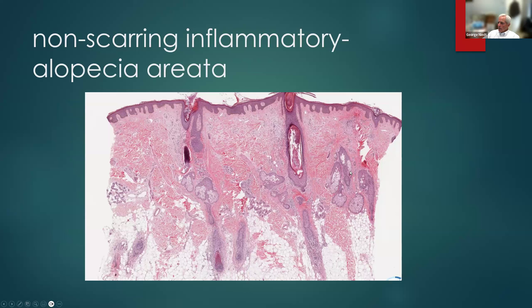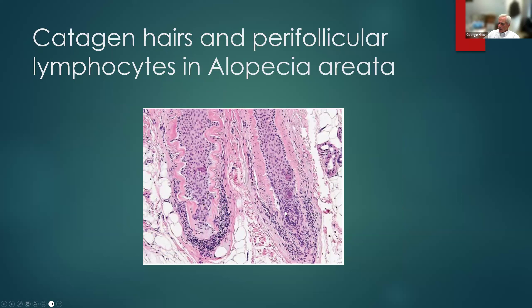Here's our classic lesion of alopecia areata. We have plenty of hairs — one, two, three, four, five, six, seven hairs — and all the hairs are starting to regress at the same stage of devolution, as Bernie Ackerman used to say. This is the histologic correlate of what we see clinically: you don't lose one hair at a time — the whole spot goes bald more or less at once, because all hairs enter catagen or telogen phase at the same time. In this particular case, there's a little bit of inflammation around the hair bulbs but not overly abundant. One thing to look for in alopecia areata is the thickened basement membranes of the catagen hairs, and of course the inflammatory cells around the dermal papillae.